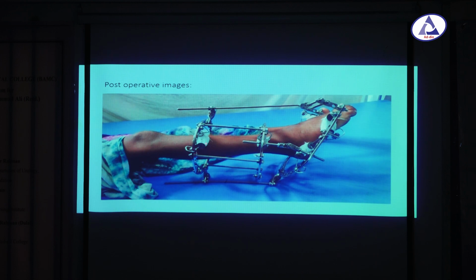This ring was applied by giving only 2 K wires at that level, and another 2 K wires at this level, and 2 K wires at this level. In total 8 thin pins are inside the body, but all the rest of the things are outside.